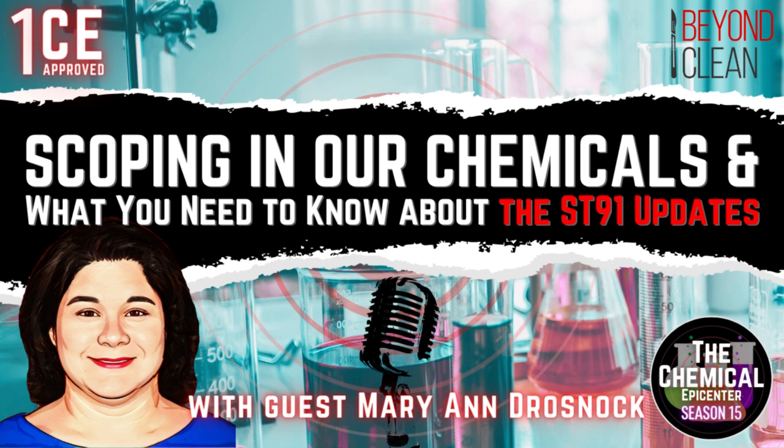And the other movement that we see a lot of, or trials of, I should say, is movement towards single-use endoscopes. That's a big discussion. Again, we could have a whole podcast just on that, right? There are many types of single-use disposable endoscopes that are now available. They come to you sterile. They're used once and they're disposed of or they're recycled. So I do think that that's going to be something that gains momentum and picks up speed over the next couple years. It already is in certain applications.